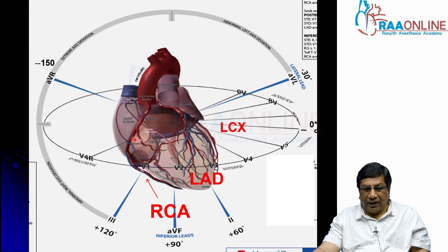So, this is your right coronary artery supplying the inferior wall. As you know, the inferior wall in the electrocardiogram is represented by L2, AVF and L3, and the right ventricle, which is supplied by the right coronary artery, is represented by V1. So, this is V1. This territory is supplied by the right coronary artery.